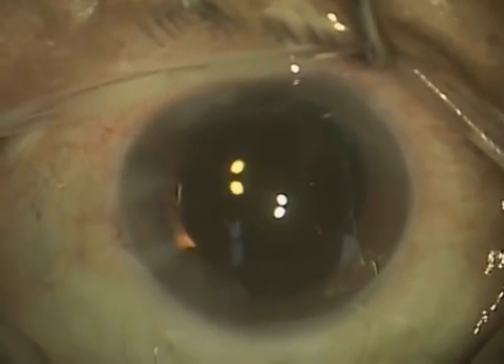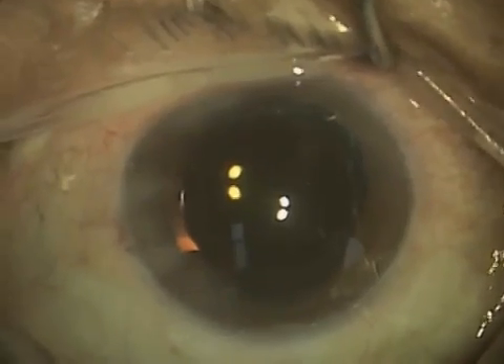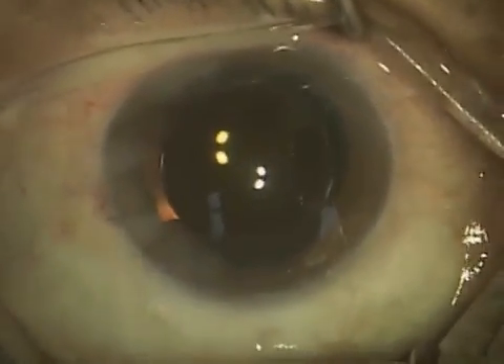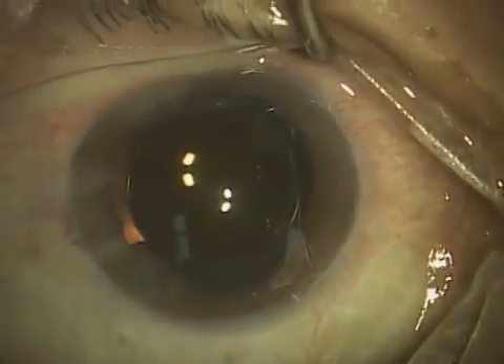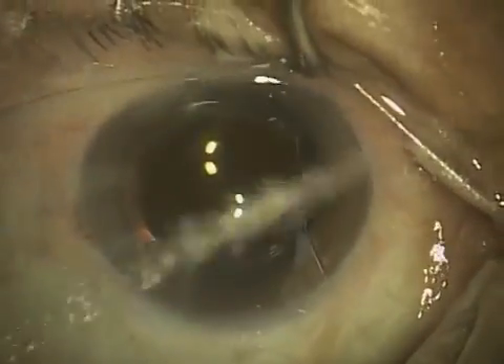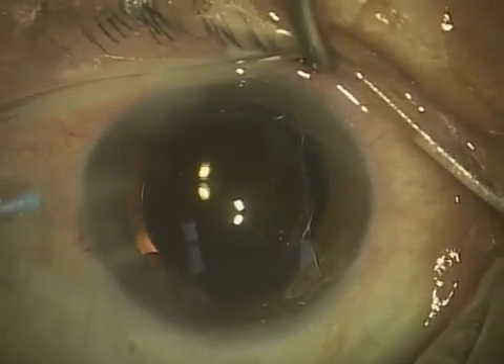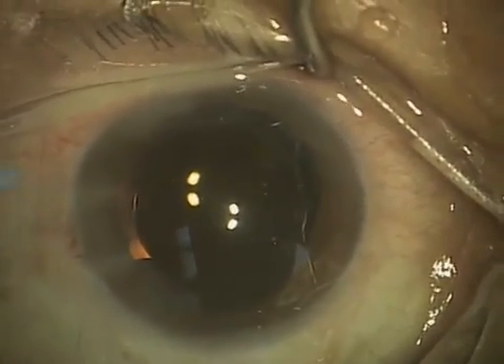That's actually going to help the lens stay in good centered position as the capsular bag heals around it. So at this point, I am going to remove the viscoelastic material because it's no longer needed. It's done its job of protecting the corneal endothelium and allowed me to safely insert the lens into the eye. So now I'm going to remove it.